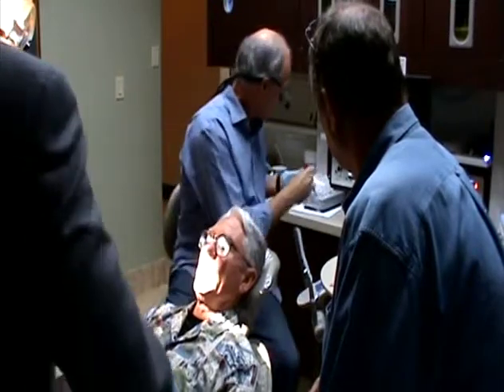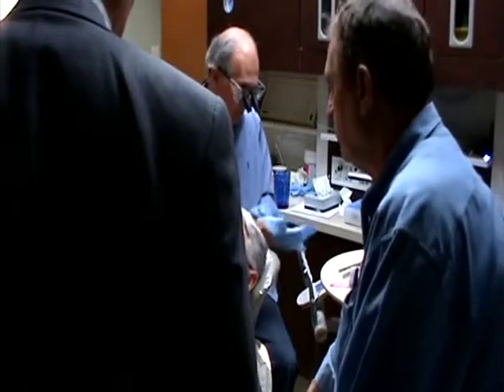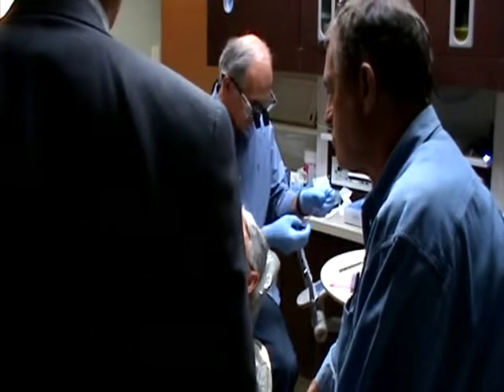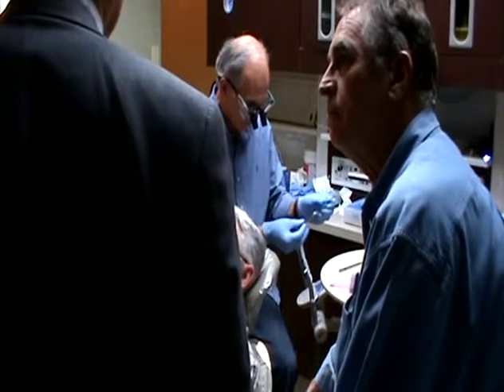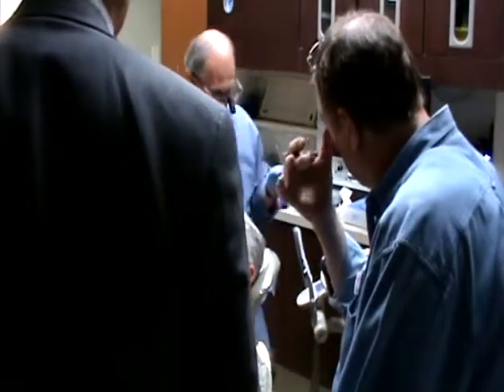So in this kind of situation, would you find that T-scan is very helpful? Not necessarily. It might be really good for this, yeah. That's what I mean. It's going to point out that one little spot. This is where I feel T-scan would have good uses, in finishing. Well, that's all it's for, the final finish.